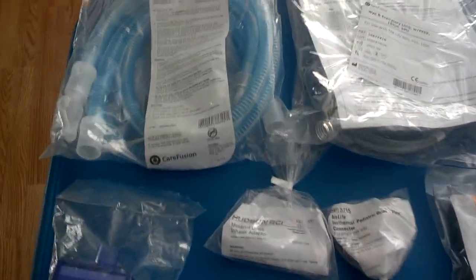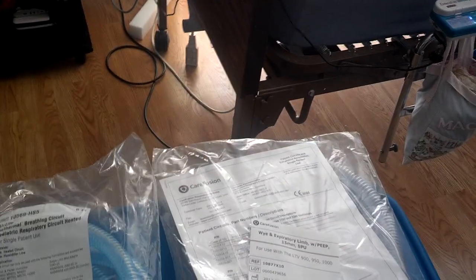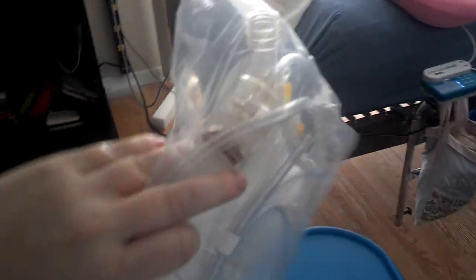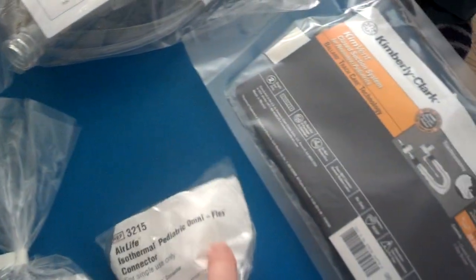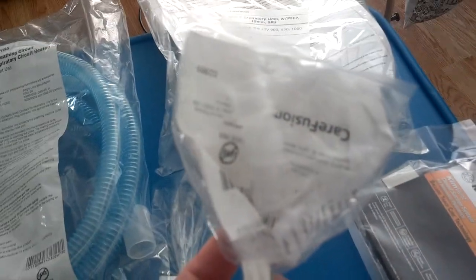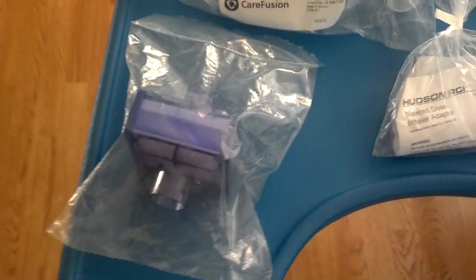I'm getting ready to do a circuit change on Taylor. We do a pediatric circuit. You'll have the blue tube which you will need to eventually connect to the white tubing, which is the one where the peep valve is on. There's a peep valve. That's the Ballard that we use. This is what I call the flex tube connector. This is a meter dose inhaler. And then this is the filter that goes on the side of the ventilator.